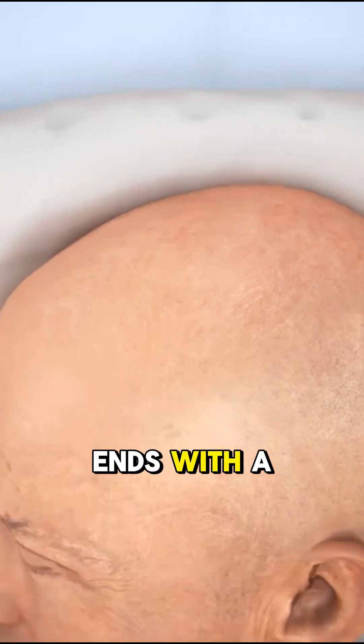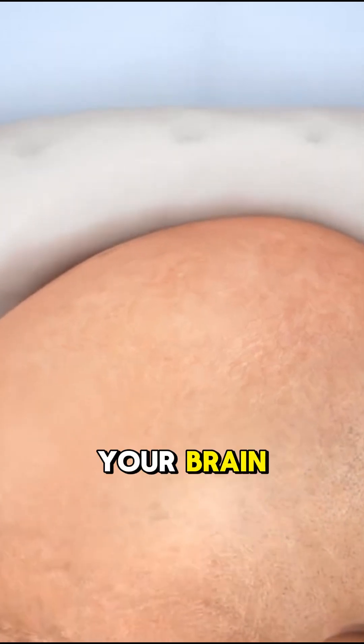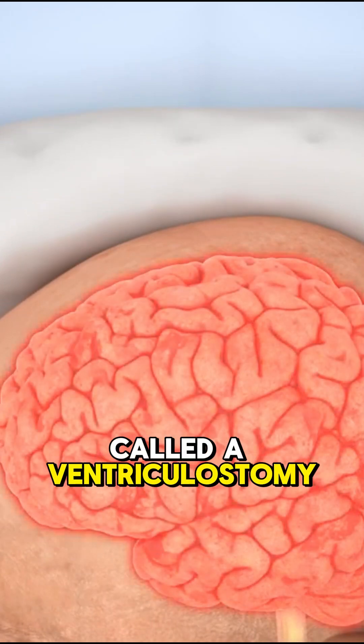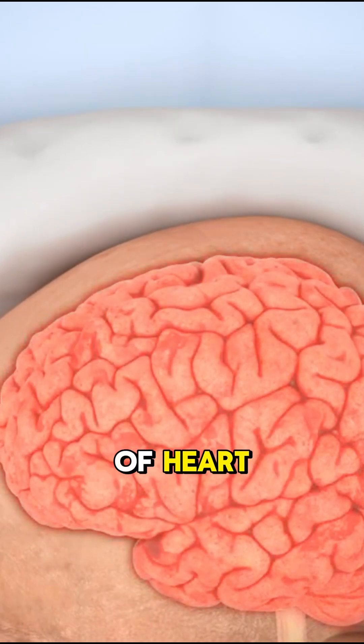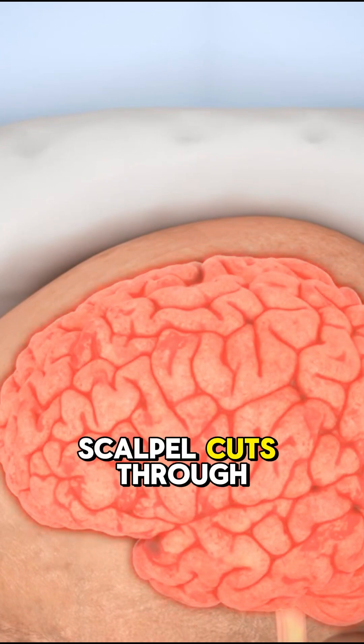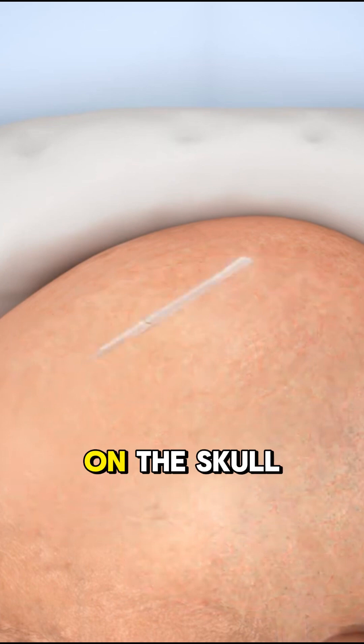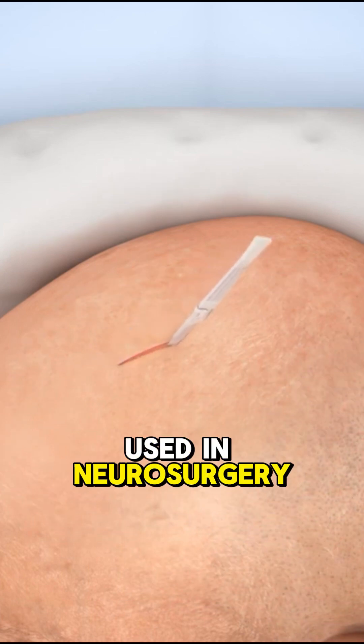It starts with a scalpel and ends with a tube draining fluid from your brain. This is a life-saving procedure called a ventriculostomy, and it's not for the faint of heart. Step 1: the scalpel cuts through the skin at a spot called Kocher's point — a safe zone on the skull used in neurosurgery.